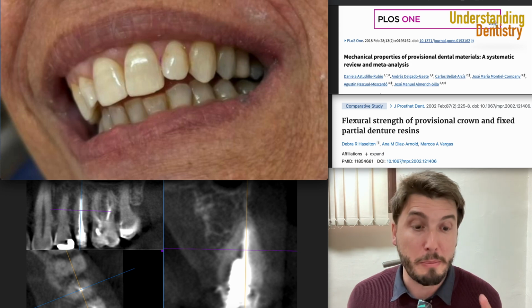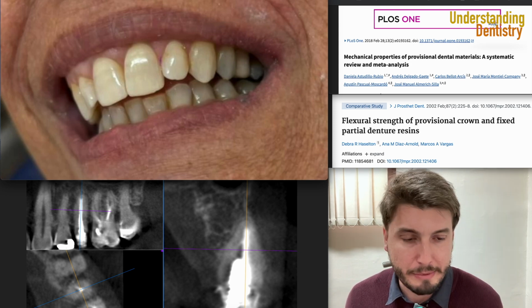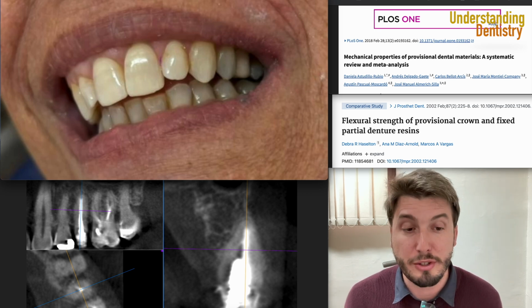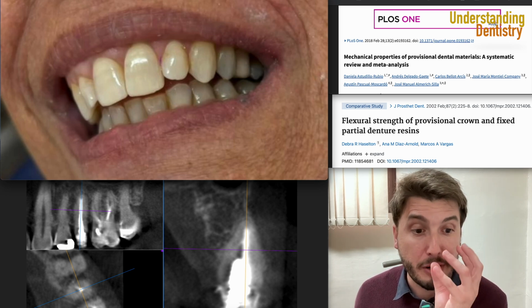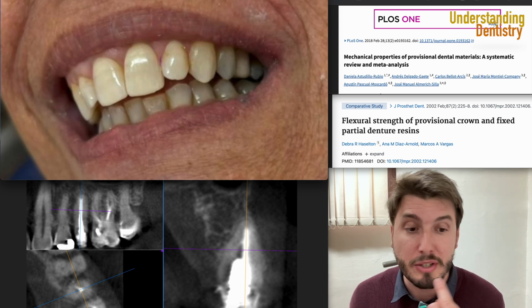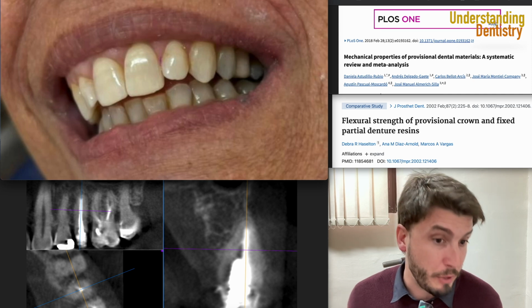So after the preparation, especially in the esthetic area, you need to have a temporary crown for basically any situation, and especially if you are going to do a tooth preparation. Even for posteriors, you need a temporary crown to initiate the remodeling of the soft tissue around this temporary crown, and not allow soft tissue to grow on the preparation, for example.